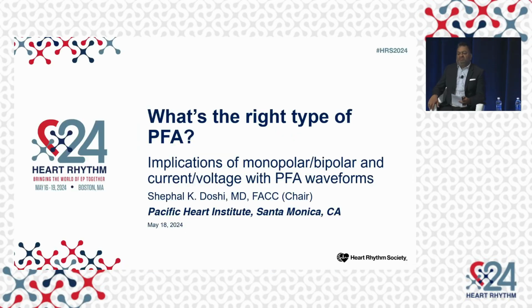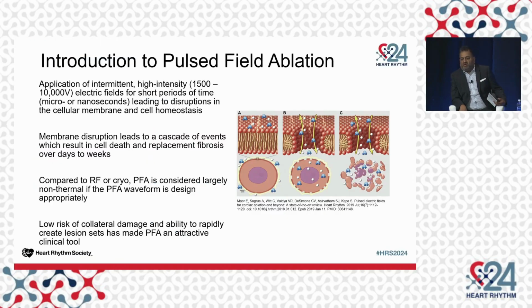I'm just going to start the intro off and give a 35,000-foot view of pulse field ablation, discussing some fundamental basic concepts about waveforms and the importance of the generator and what it can do and how it interacts with that, discussing monopolar, bipolar, voltage, and current.